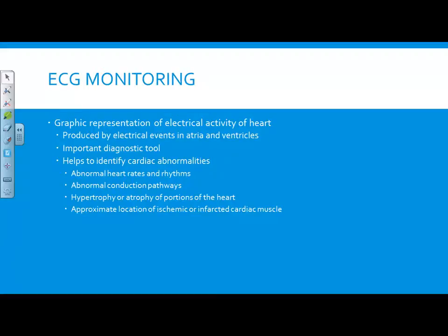Flip side, I may see ventricular tachycardia. Alright? Something that most of y'all should be familiar with at this point. I don't see any atrial activity, so I know that the atria either is trying to work but is being overridden by the ventricle, or just the ventricle is firing. Is that always the case, though? Is that always going to be 100% foolproof? No. That's why you treat the patient and not the monitor.